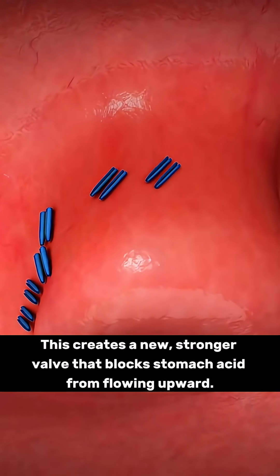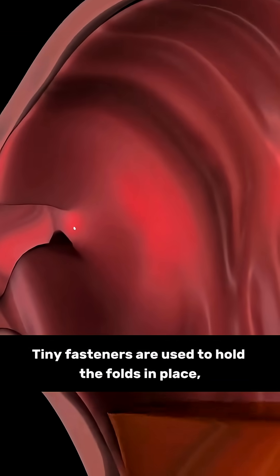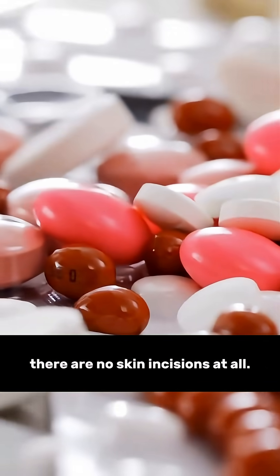This creates a new, stronger valve that blocks stomach acid from flowing upward. Tiny fasteners are used to hold the folds in place, and since everything is done internally, there are no skin incisions at all.